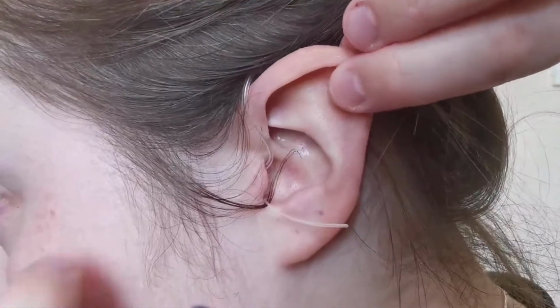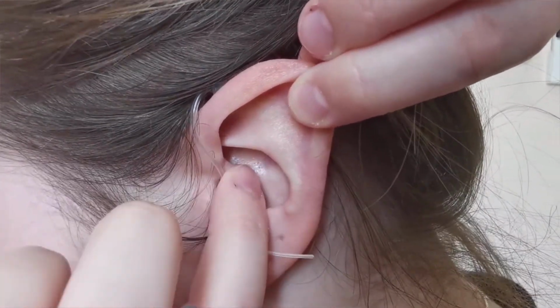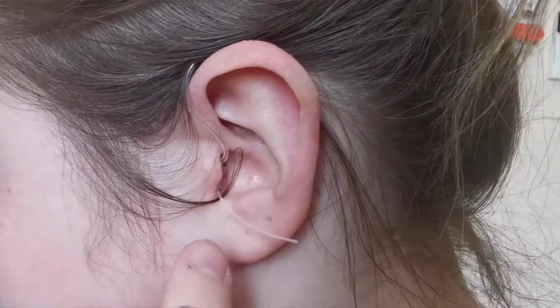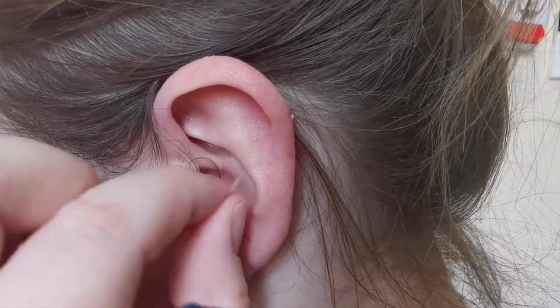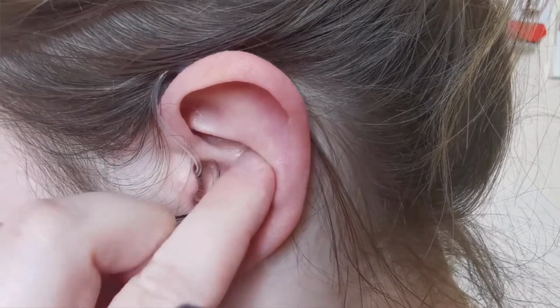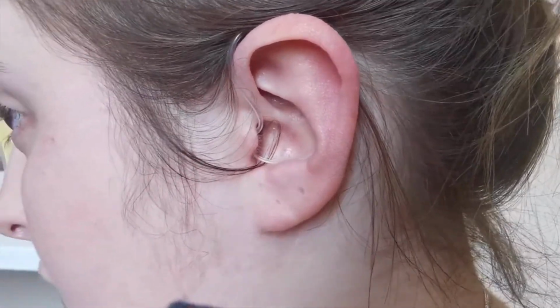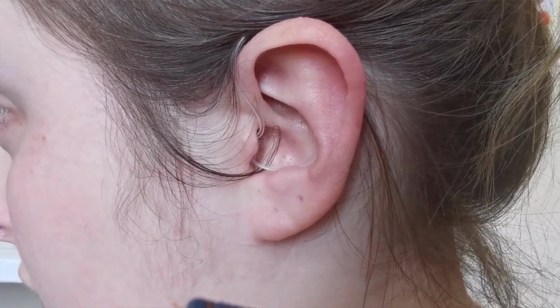You can pull the ear to straighten the ear canal, which makes pushing the tubing in easier. You then place the anchor into the bowl of the ear. This is how you insert a hearing aid.